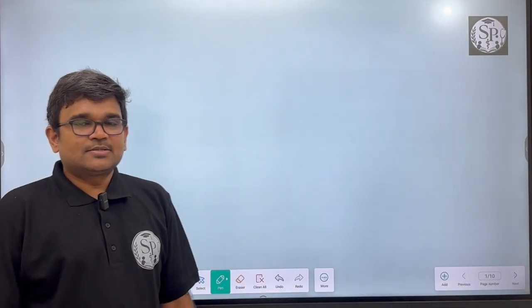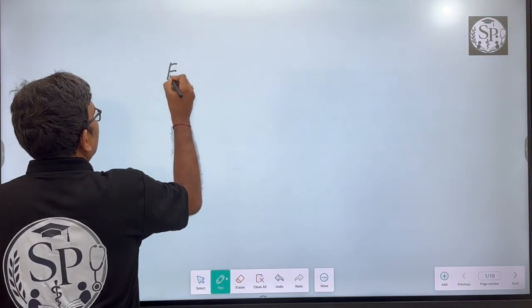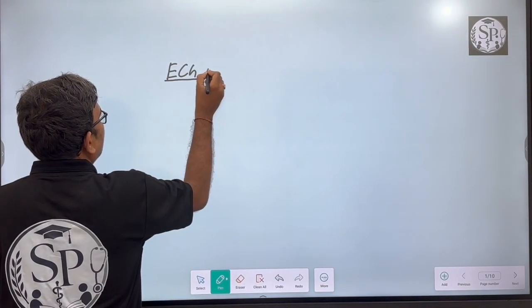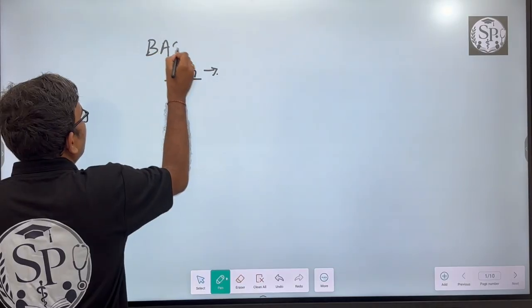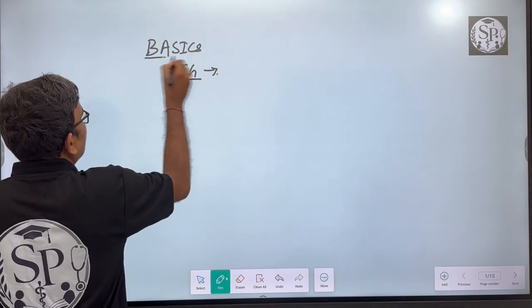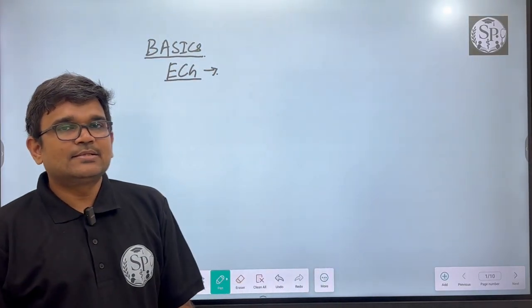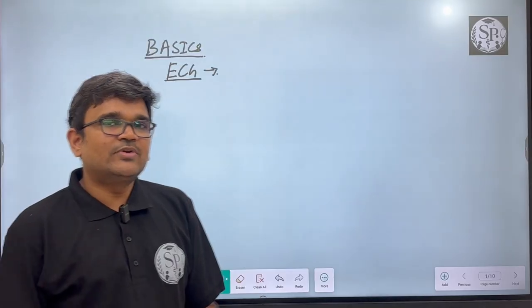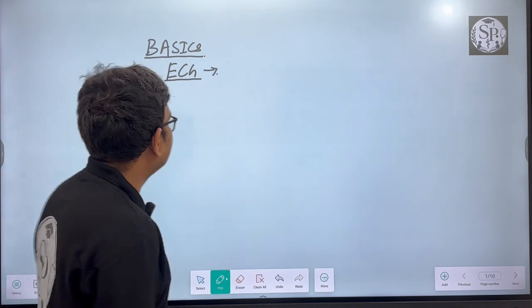Now we will discuss the basics of the ECG. ECG is the graphical representation of depolarization and repolarization of cardiac chambers.